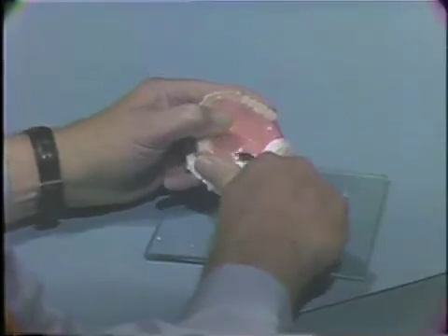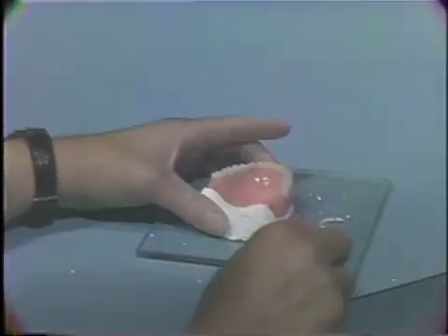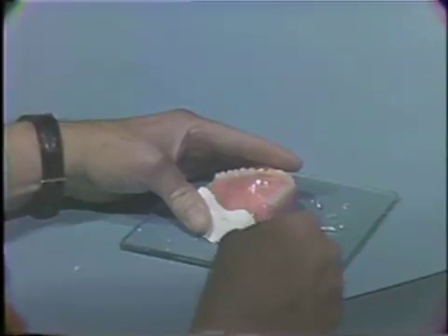After the impression plaster has set, carefully tease the denture from the impression plaster cast. If the cast fractures in the area of the posterior palatal seal, a new cast must be made.